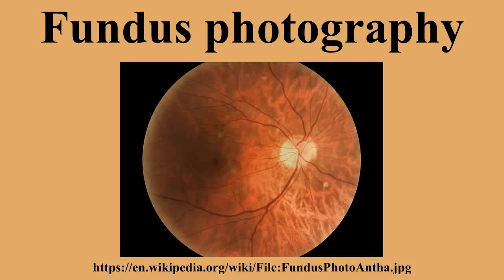However, despite recent advancements in technology and the development of stereo fundus cameras, which are able to provide three-dimensional images by superimposing two images, most fundus cameras in circulation are only able to provide two-dimensional images of the fundus. This limitation currently prevents the technology from superseding the current gold standard, which is indirect binocular ophthalmoscopy. The following are some of the advantages and disadvantages of fundus photography.